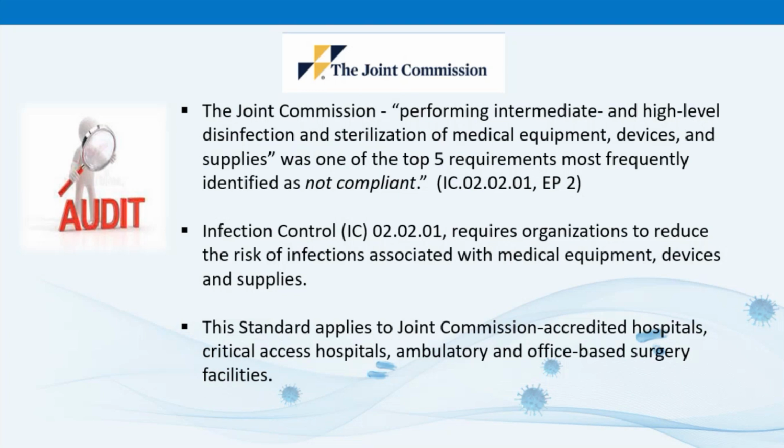The Joint Commission found the most vulnerable locations for lapses in sterilization, or HLD, are ambulatory care sites, including office-based surgery facilities, and decentralized locations in hospitals. Infection Control 02.02.01 requires organizations to reduce the risk of infections associated with medical equipment, devices, and supplies. And this standard applies to Joint Commission accredited hospitals, critical access hospitals, and ambulatory and office-based surgery facilities.